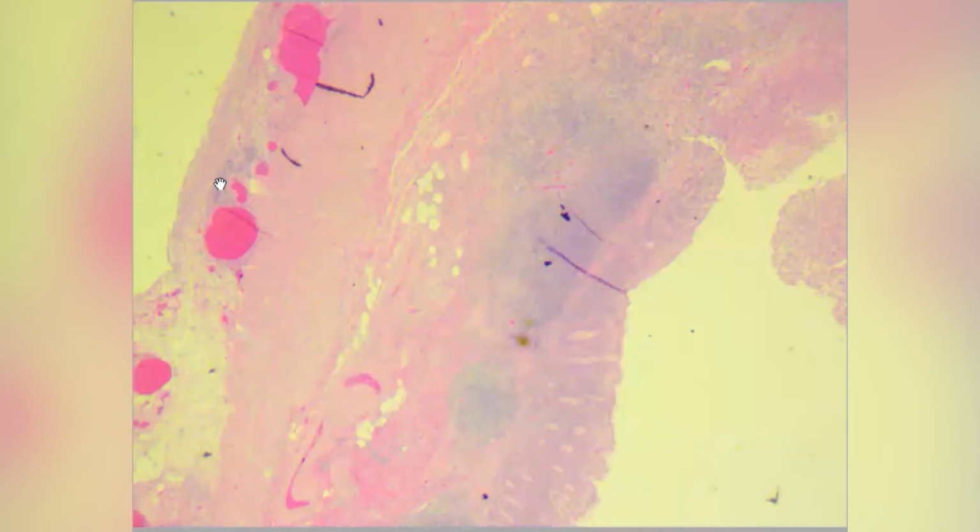To diagnose acute appendicitis, you need to find neutrophilic infiltrates in the muscularis propria, which will be here.